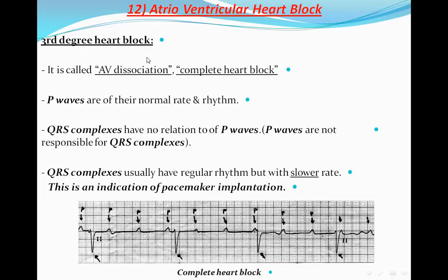Third degree heart block is a type of AV dissociation and can be called complete heart block. We will find P waves in the ECG with a normal rate and equal P-to-P interval. These arrows point to the P waves — they are regular and at a normal rate. Calculating the big boxes, it is almost four, giving a P wave rate of about 75 per minute. However, the QRS complexes, although regular, are very slow — about 10 big boxes — so the QRS rate is about 30 per minute. There is no fixed PR interval.